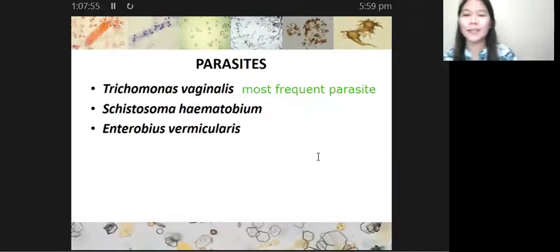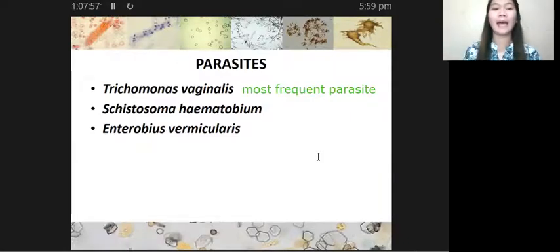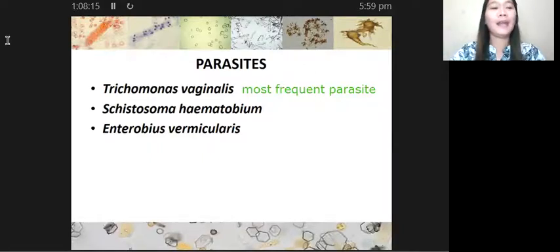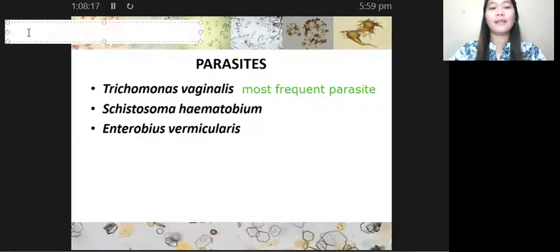Favorite nila ito sa board exam. Okay? So your Trichomonas vaginalis, it is the most frequently seen parasite in urine and it is associated with your ping pong disease. Okay? And take note that your Trichomonas vaginalis, it is only reported.